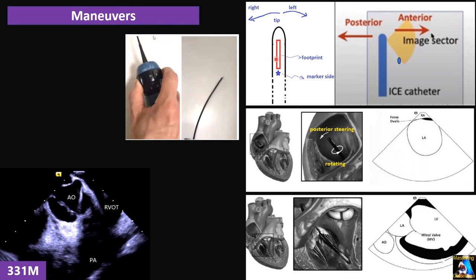Intracardiac echo imaging to recognize thrombus and prevent systemic embolism. Figure A1 corresponds to a patient referred 2 weeks after a failed ablation of left atrial flutter, complicated by a postoperative transient neurologic deficit. The TE shows a small ASD with left to right flow at the site of the prior transseptal puncture, but no thrombus is visualized and the patient is clear for ablation procedure.